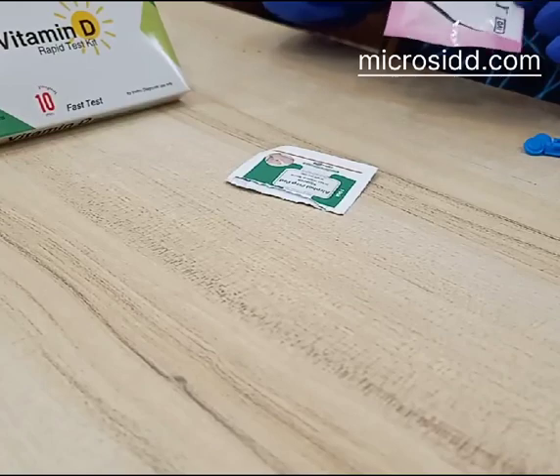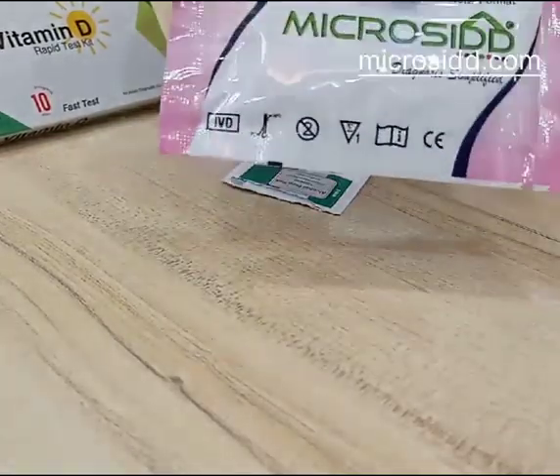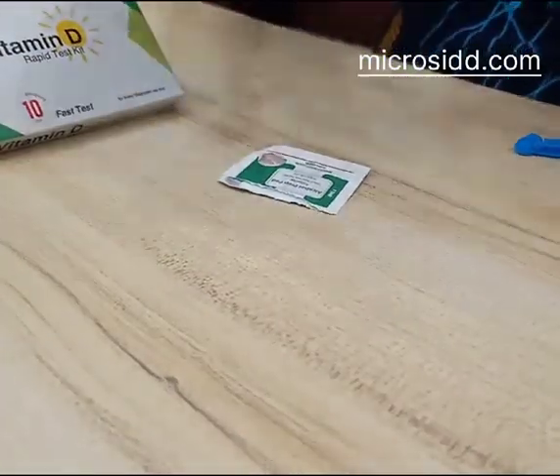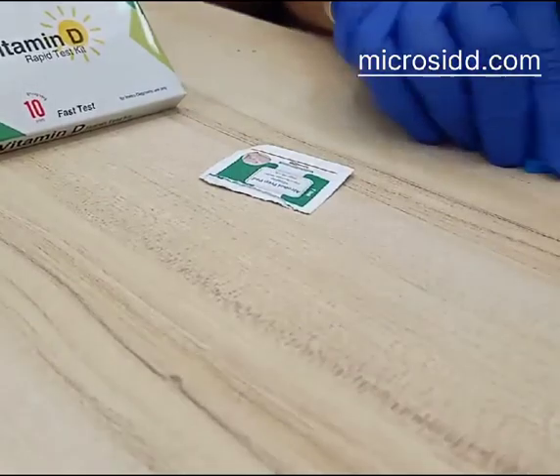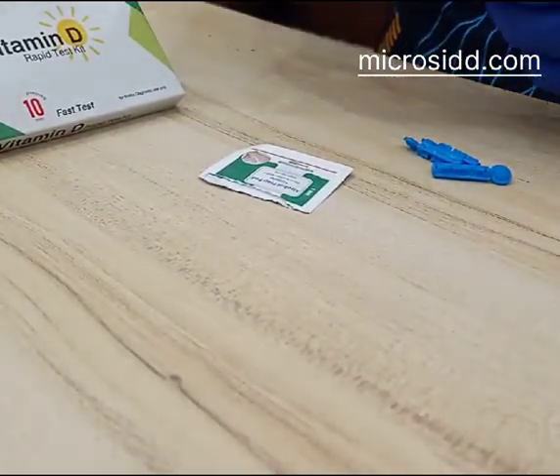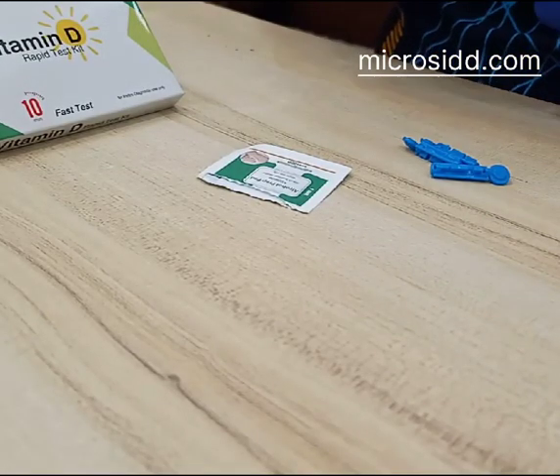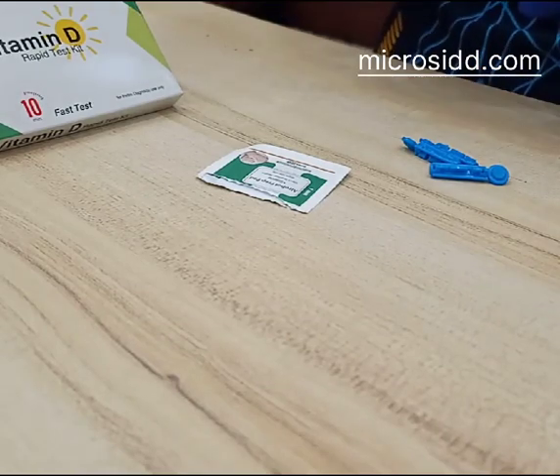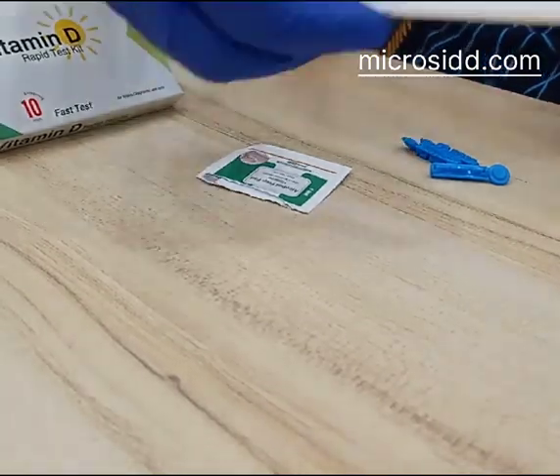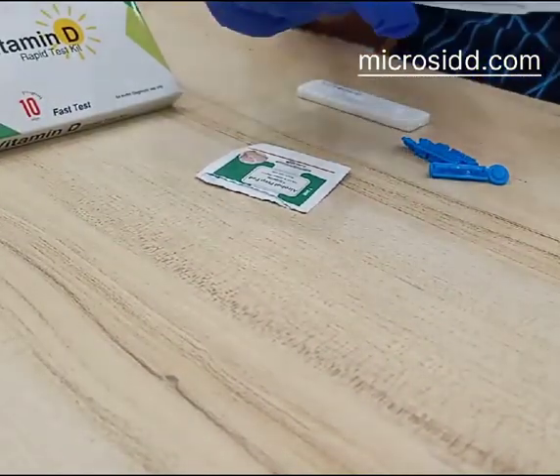Hi, today we are going to demonstrate how to do a Vitamin D test. This is a pack of microZ Vitamin D test kit. Firstly, we have to open the vial a bit if required.